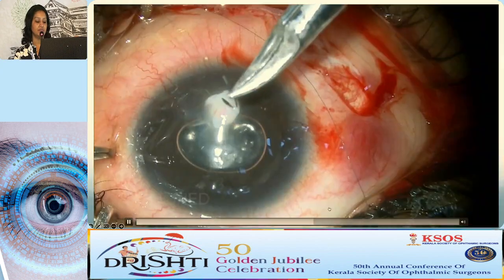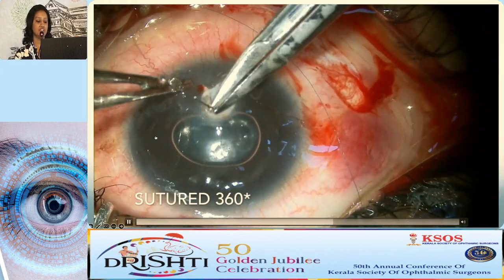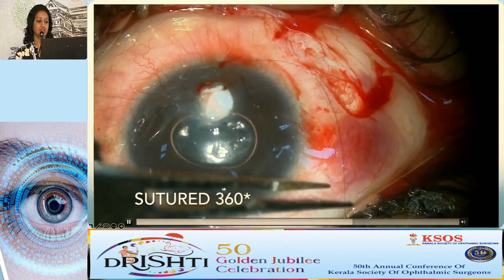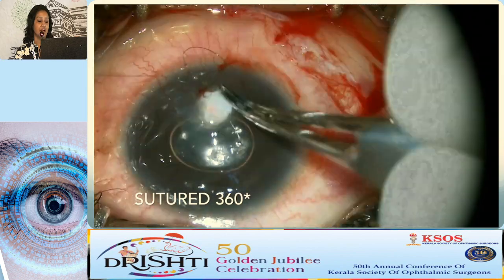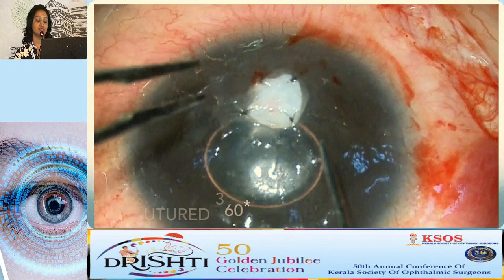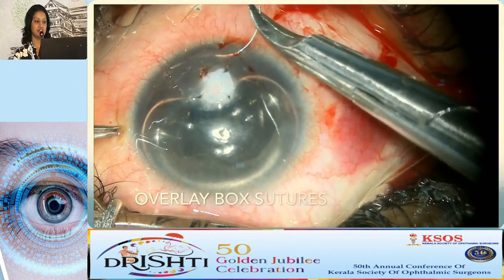And once you've tucked it in, then you can take sutures all around, like how you would take PK sutures. Make sure you don't pull them too tight, or the graft will get dislodged. And after this, you can even put an overlay of the box sutures that were shown in the first surgery, as it's being done here.